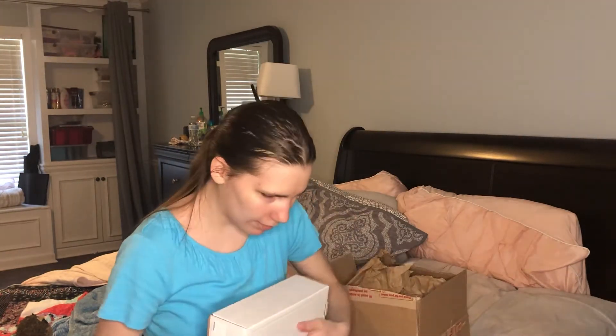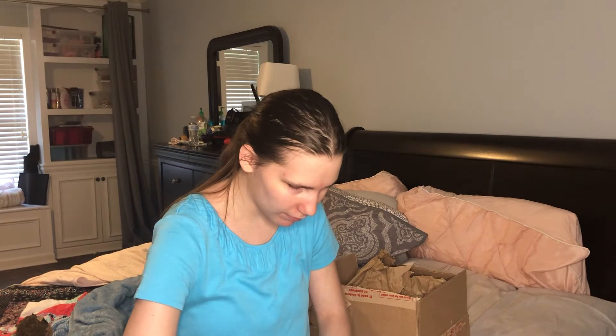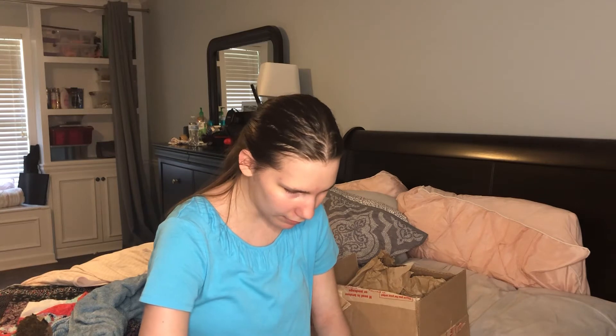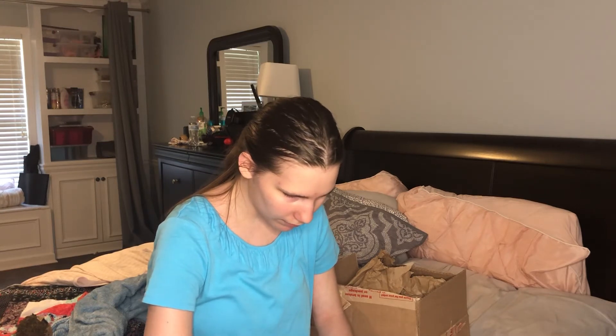There's Braille in this box! Whoa! Is that Braille? I swear that feels like Braille. I think it is Braille. I don't know what it says though. It's weird, but it's so cool. It feels like Braille.